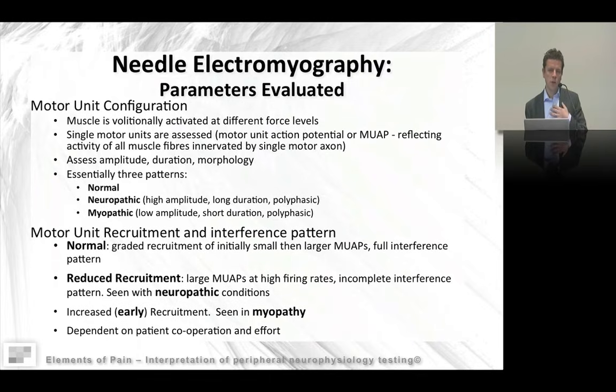So those are single muscle fibers firing off at a very rapid rate. The exact reason why it happens in myotonic dystrophy is unknown. Some of the other myotonic conditions, essentially, are related to channelopathy, so they're hyperexcitable muscle fiber membranes.